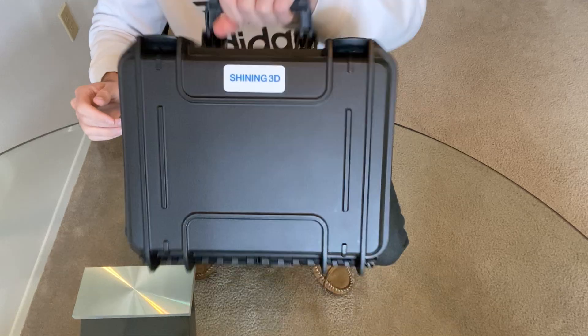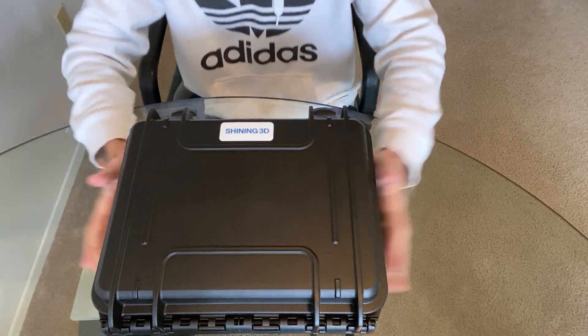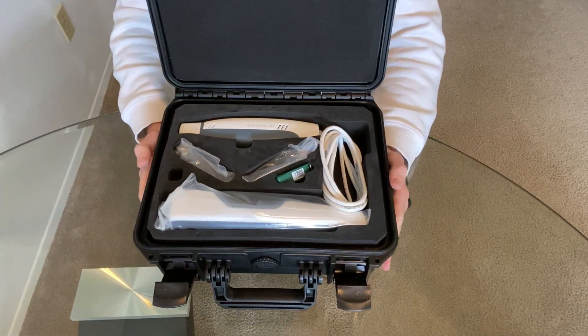Spin it around — Shining 3D, nice handle to compact everything in. So I'm gonna go ahead and just unbox it. I have two levers and there it is. This is what you're gonna get when we drop off your Shining 3D in the mail.